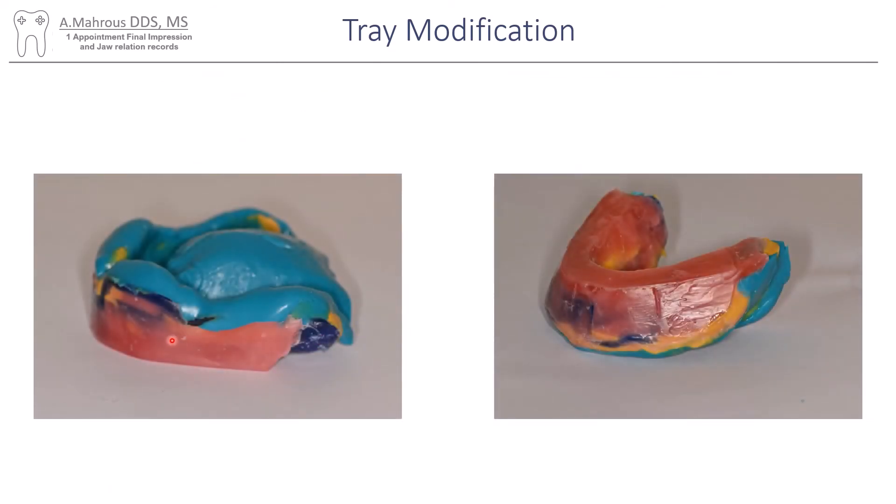Then I'll add some wax for the wax rim, and you can do that in that same appointment so you save the patient from having to come again for a specific jaw relation appointment. Now sometimes patients need to have that trimmed more, and if the patient has such a small vertical dimension you might not be able to get this done with this tray, but for most patients this works out pretty well.